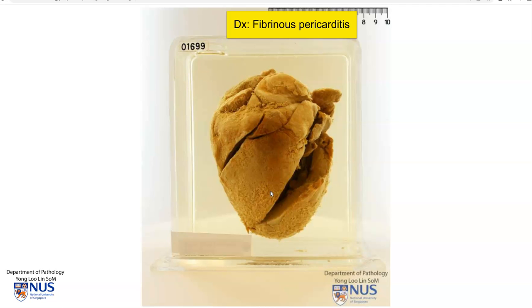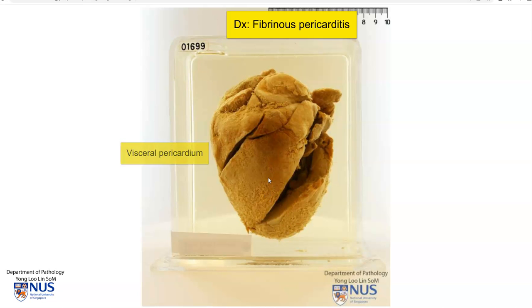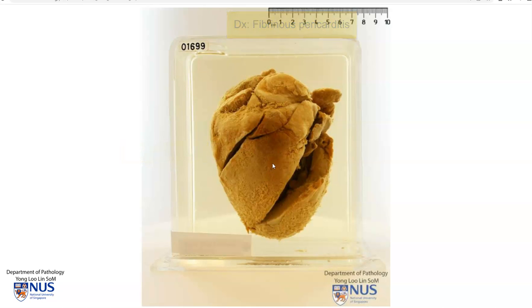Here we are actually looking at the surface of the visceral pericardium or the epicardium of the heart. This is usually lined by a single layer of mesothelial cells and hence the appearance is quite glistening and smooth.